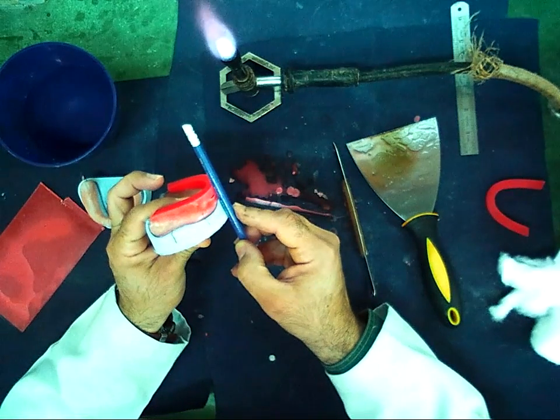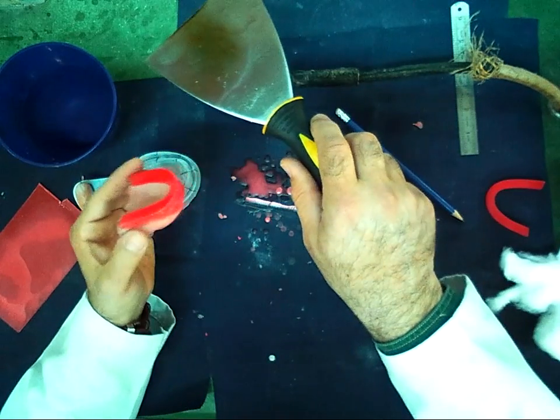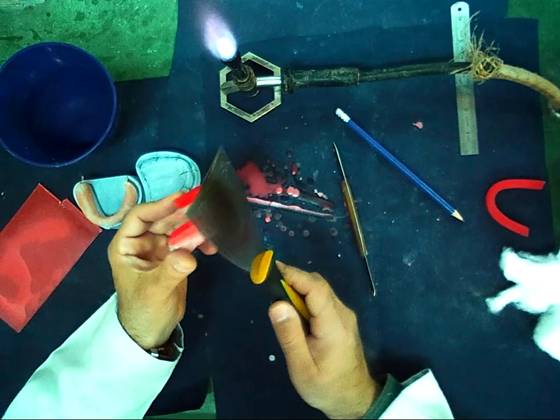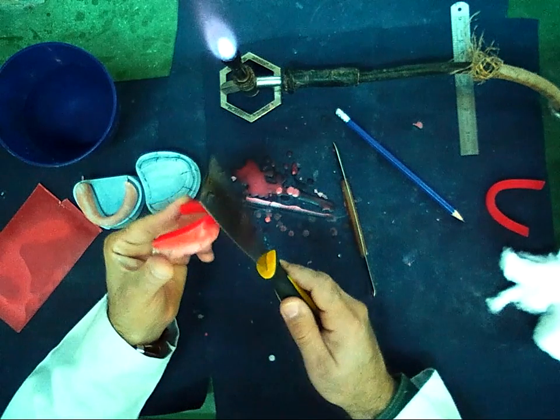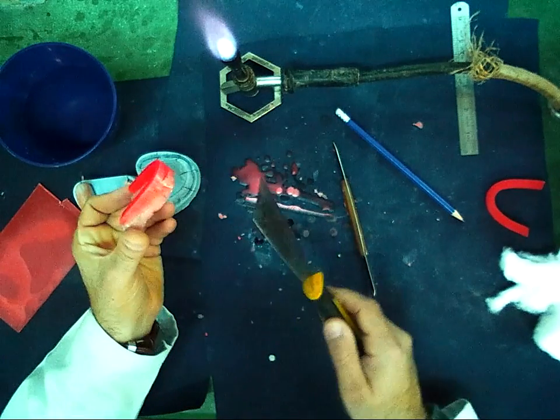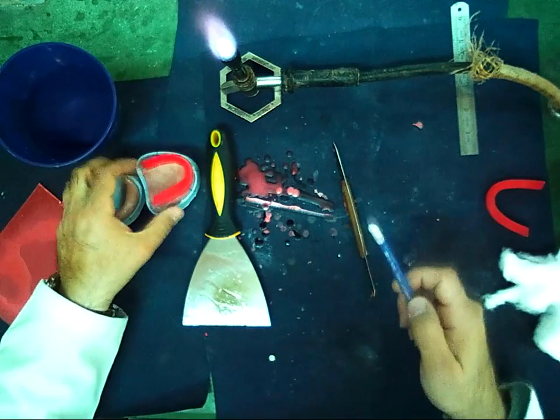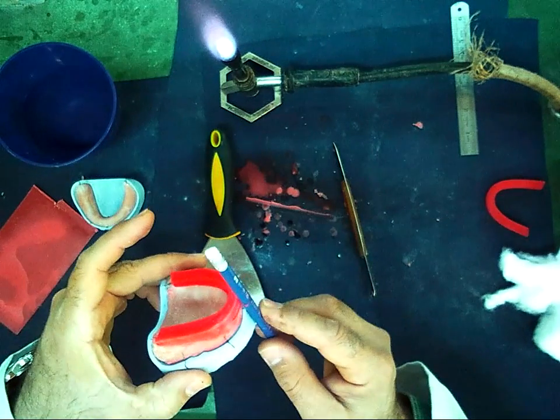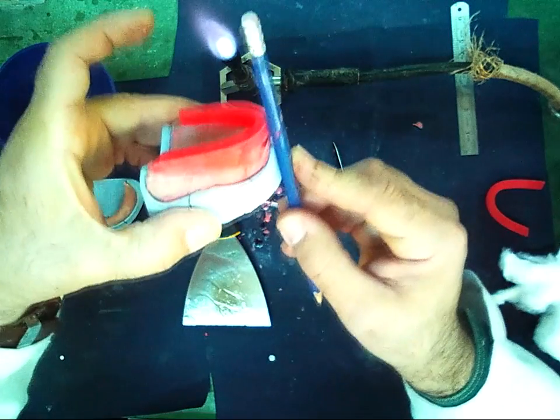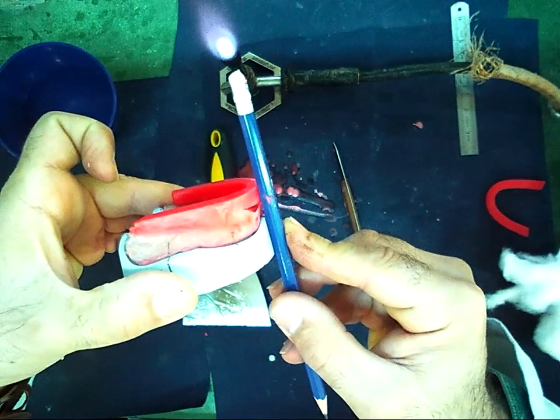Still there is a little space. Now I see the pen touches the occlusal plane and there is no space.